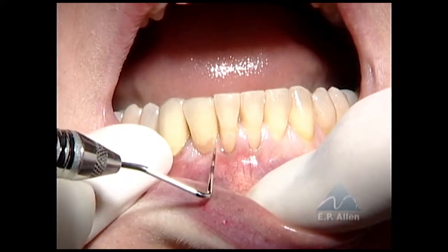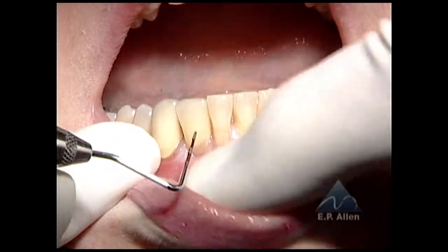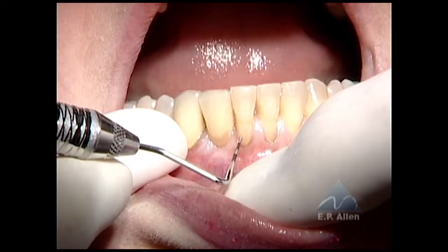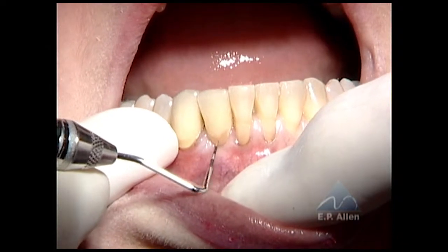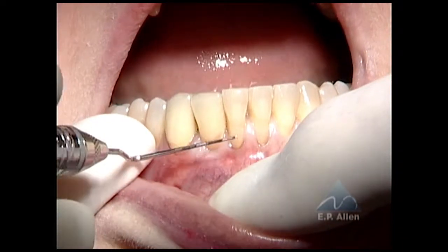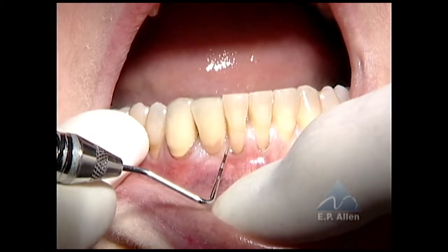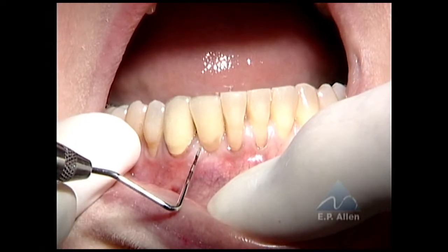This is going to be a bit of a challenge. It just means that if I'm unable to go under this, I don't need to elevate it — I just need to get underneath the tissue in this region. If it proves difficult, we'll just make an entry incision to gain access.